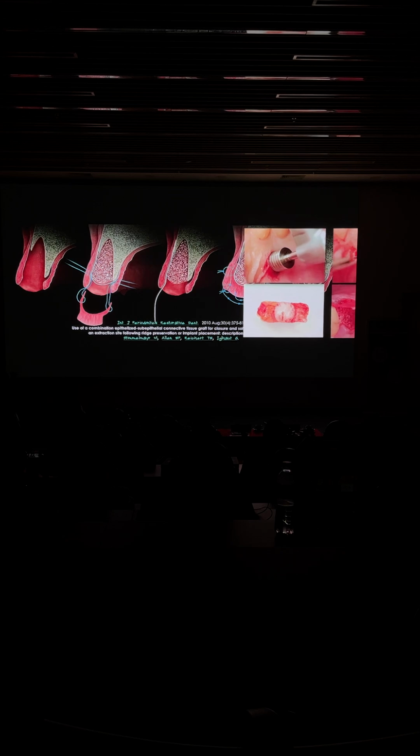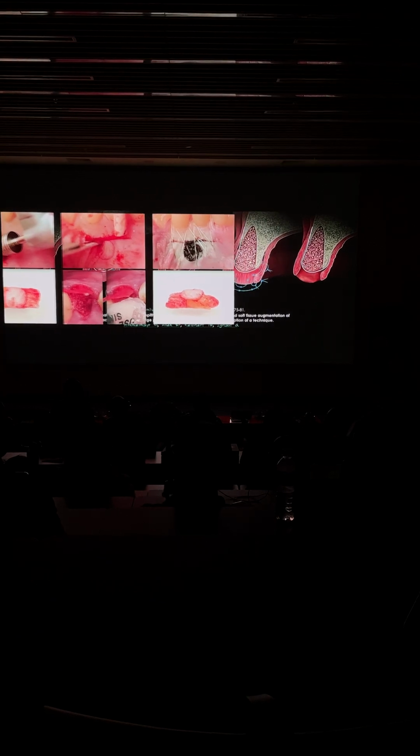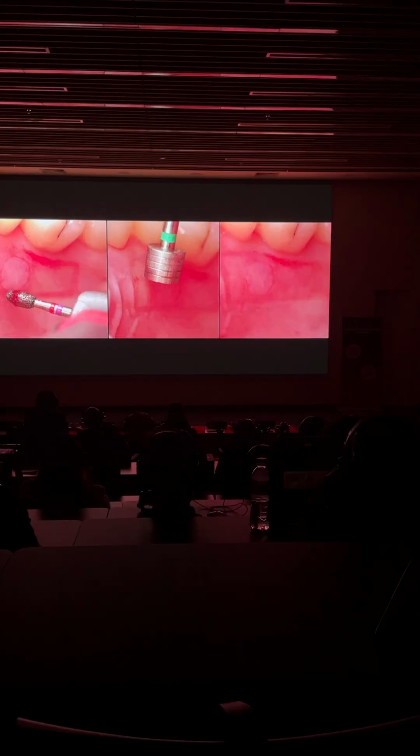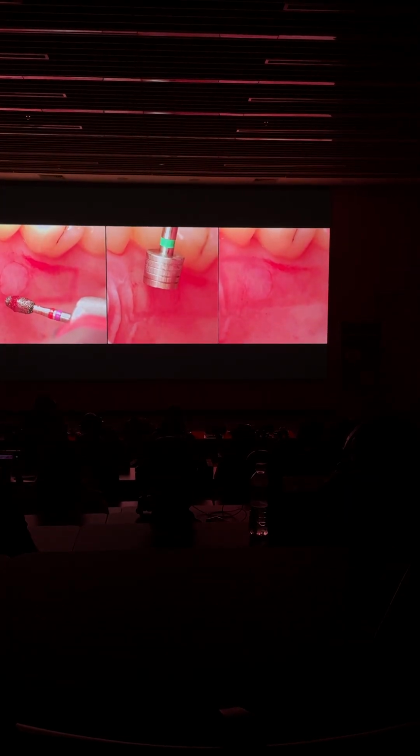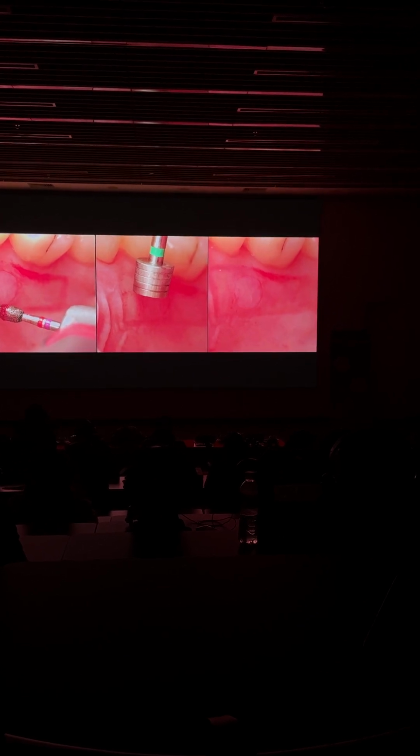Usually I don't use this technique, it's really painful. Today what I do is I de-epithelialize the distal and mesial aspect, and I take only, this is about perforation of 1 millimeter, and then I take all the lamina propria from front to back. This is really painful for the patients. So you can see how we do it today. I go over 1 millimeter each side. I de-epithelialize the distal and the mesial.